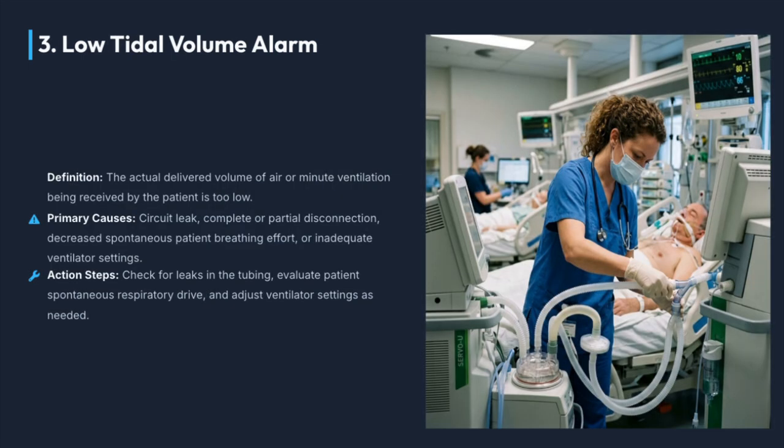A low tidal volume alarm means the delivered air volume is insufficient. This may result from circuit leaks, disconnection, or changes in the patient's breathing effort. Evaluate settings and verify system integrity.